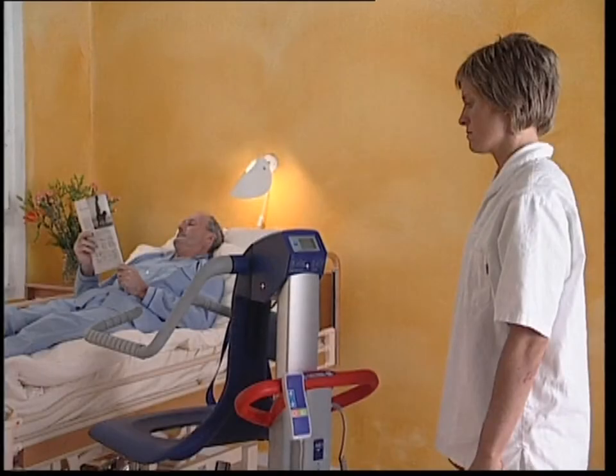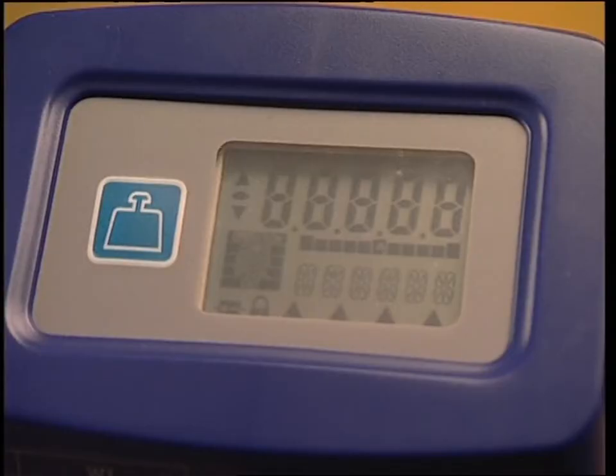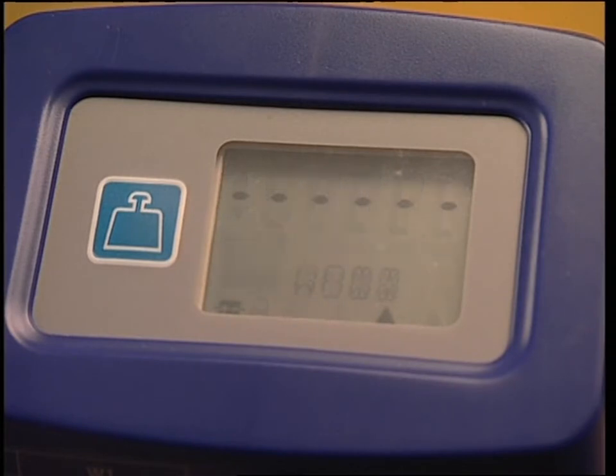There are two ways to weigh the resident with the Alenti scale. Firstly, before the resident sits on the chair, push the button. A display test is performed. All segments are shown for about one second. The display shows weight and then after a few seconds, 00.